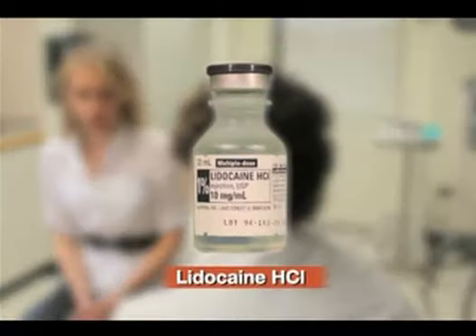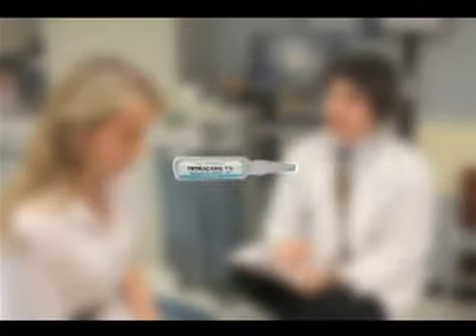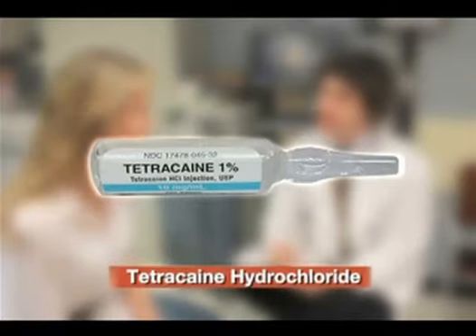Ask whether the patient has known allergies to local anesthetics, antiseptics, or topical antibiotics, and any reactions to tape. Although true allergic reactions to lidocaine are rare, if a patient reports a history of a reaction to lidocaine, then a non-amide anesthetic, that is, an ester anesthetic such as tetracaine, may be used instead.